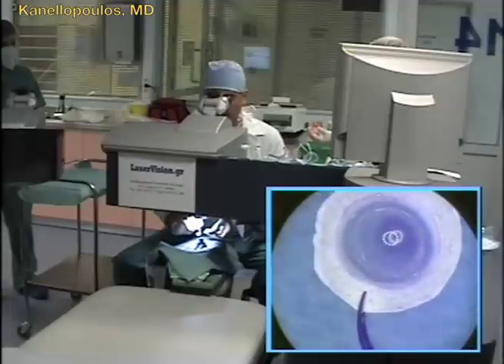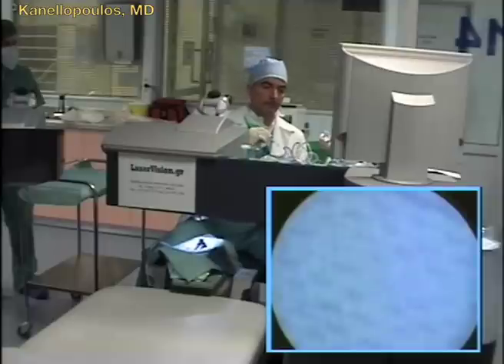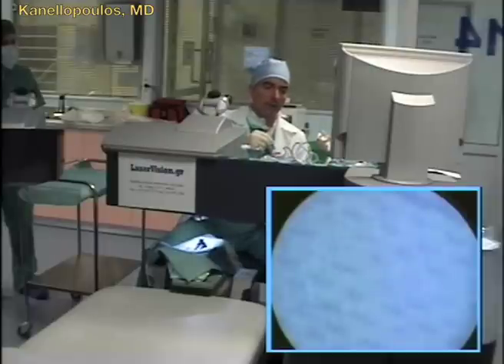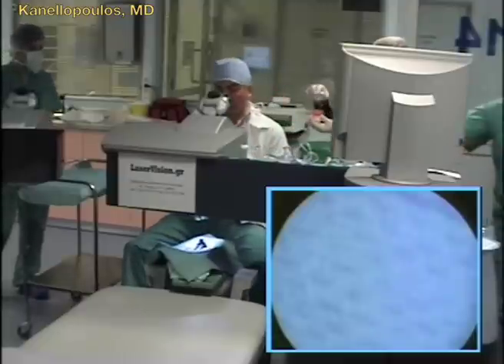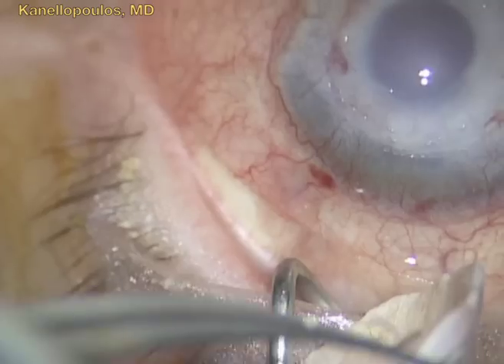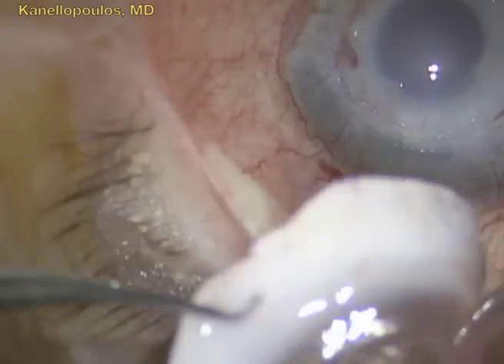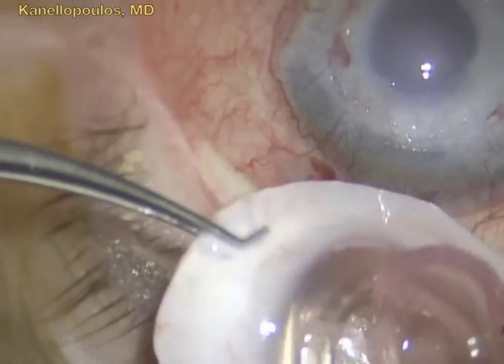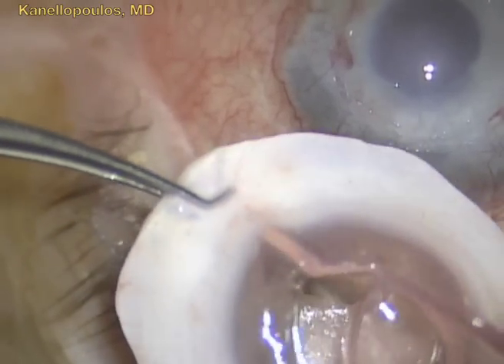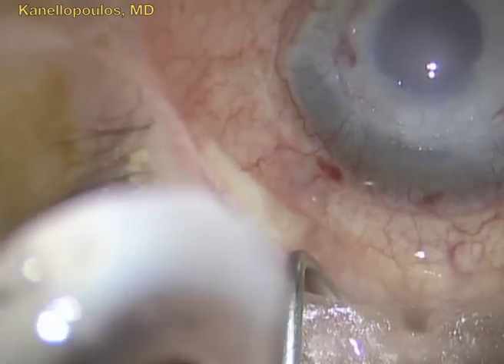This is now the donor cornea with the trefination — it will be placed back into the storage vial. The majority of U.S. banks use Optisol solution for storage. And now we're back in the O.R., where the actual tissue is very easily removed from the donor cornea scleral rim.